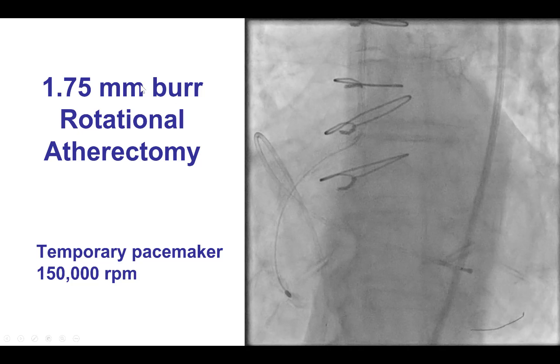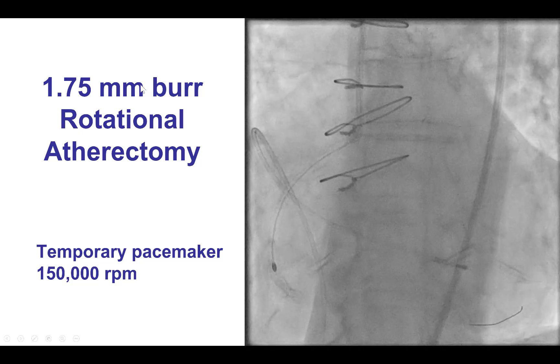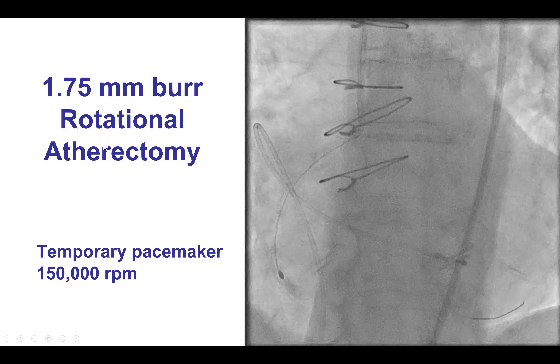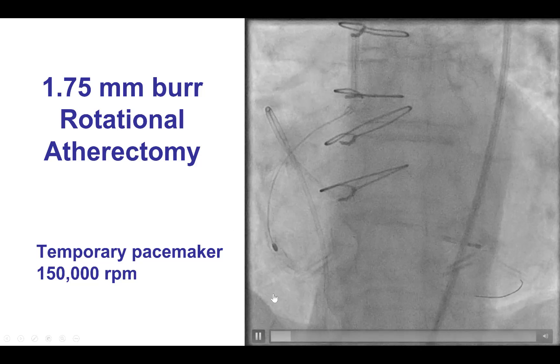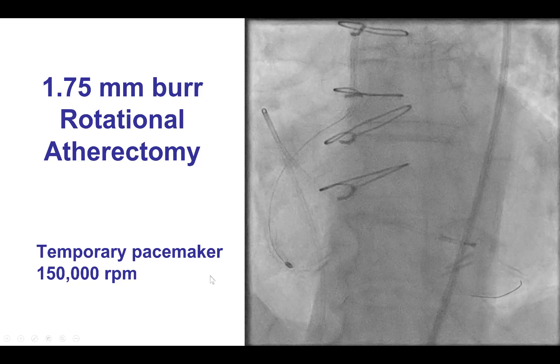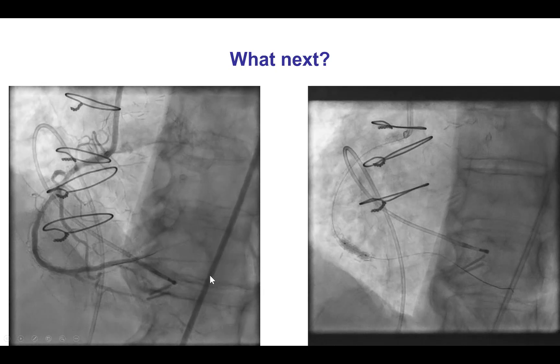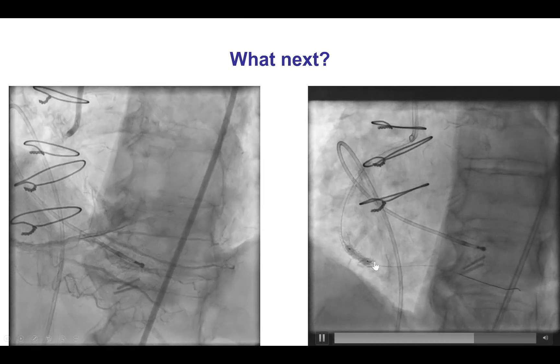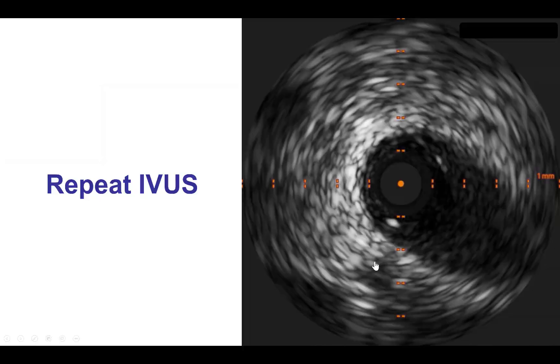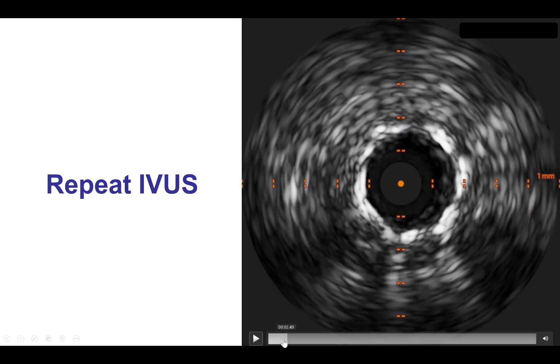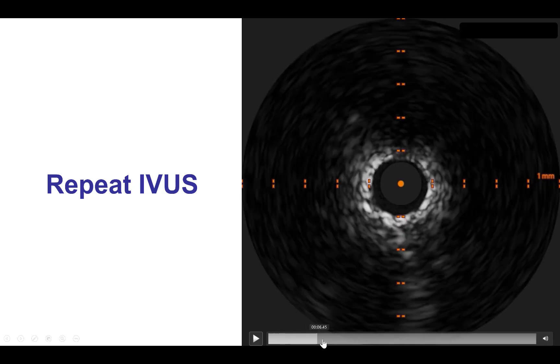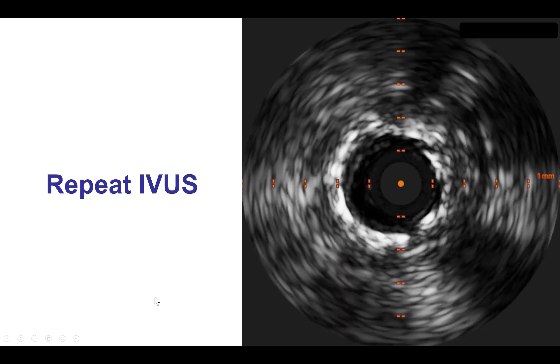We decided to go larger on the rotablator and used a 1.75 mm burr. But once again, there was no improvement — there was still a waist in the balloon. IVUS, which is critical for such lesions, confirmed the exact same area of under expansion, with good expansion distally and proximally.